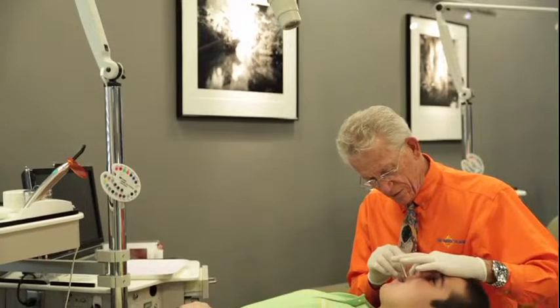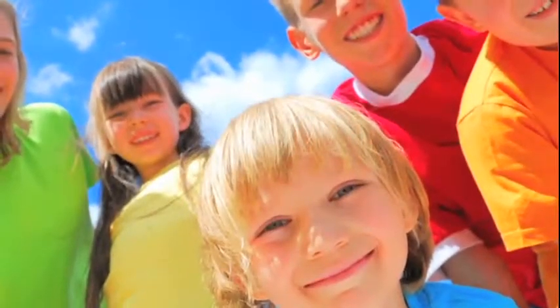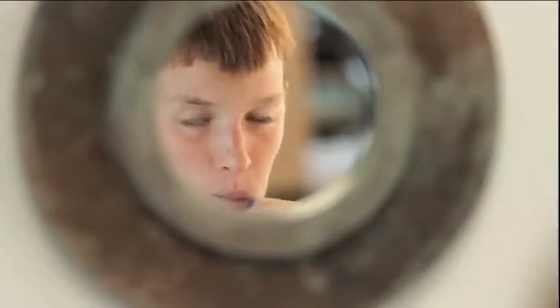Congratulations on taking the first step toward a great smile and a healthy bite. The treatment you're starting today will provide a lifetime of benefits, from added confidence to improved health. And one of the most important ways to protect your investment is to take good care of your teeth during treatment.